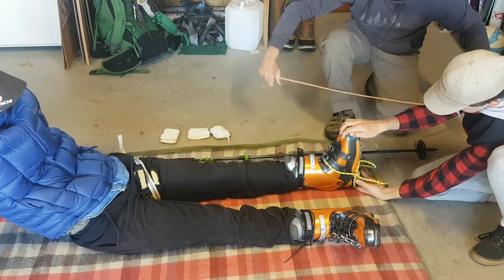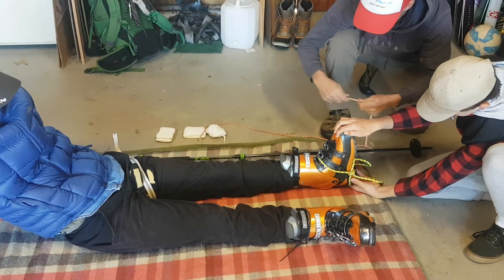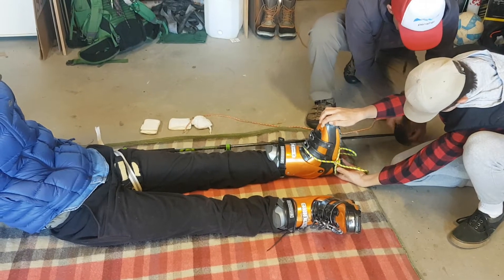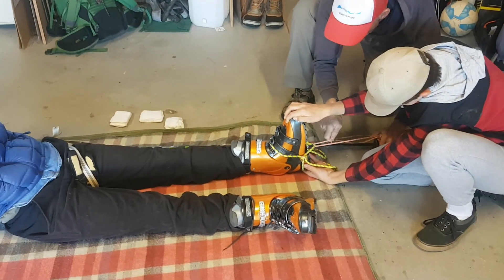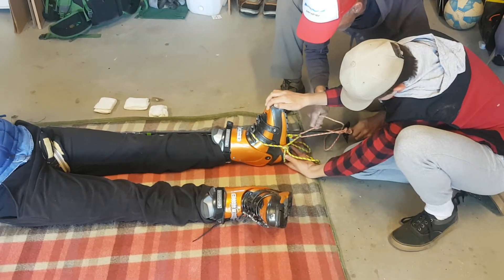Get a little bit of cordage, and to start with we'll just tie off — we've got plenty of room here — tie off a figure eight. Put it around the bottom. This pole's pretty much extended out a fair way, and we'll go in around. So we're going to put the traction on now, remembering we've got to overcome that great big quad muscle.